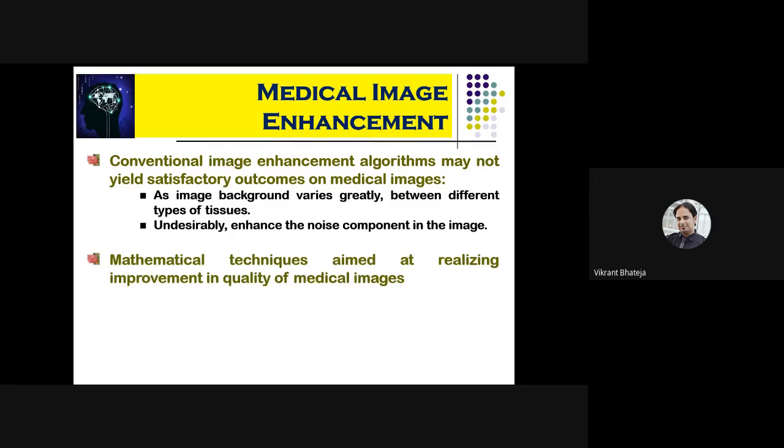Now, let's talk about medical image enhancement. Medical image enhancement is where you deploy image enhancement algorithms, which are mathematical tools via which you can control or improve the contrast of a particular image. One can also enhance the noise component present in that image, which could be undesirable.